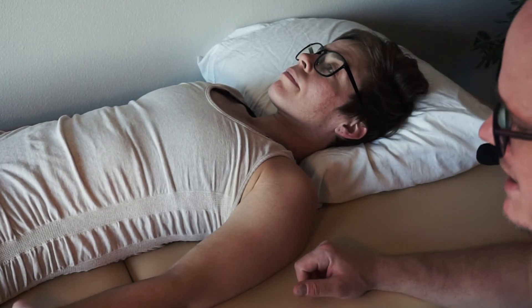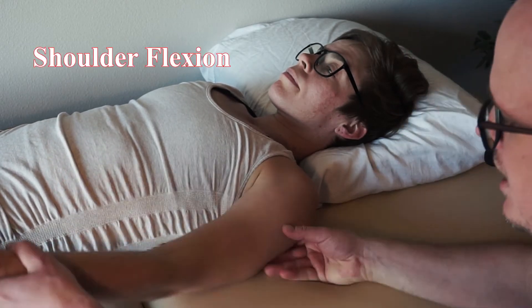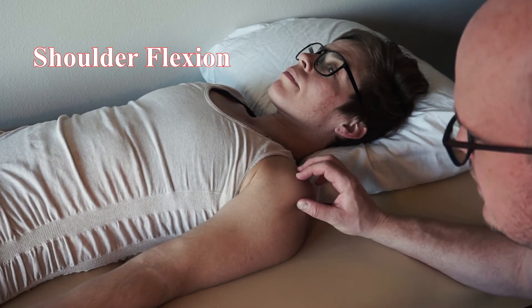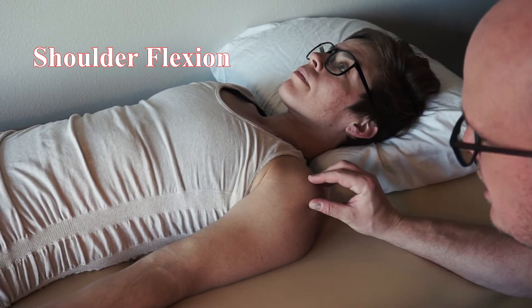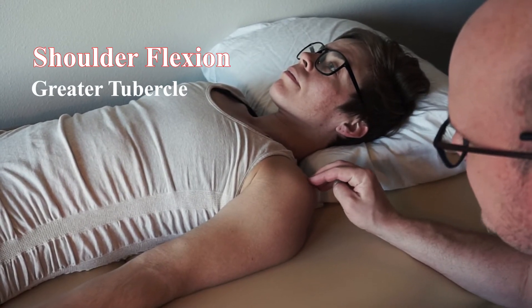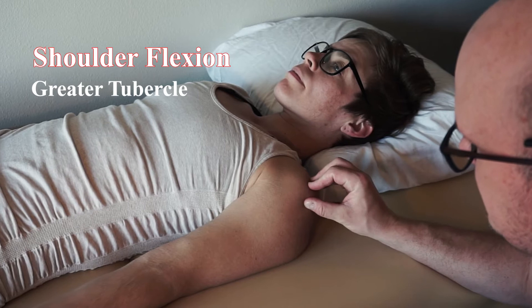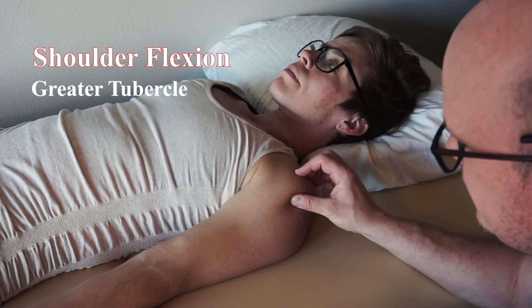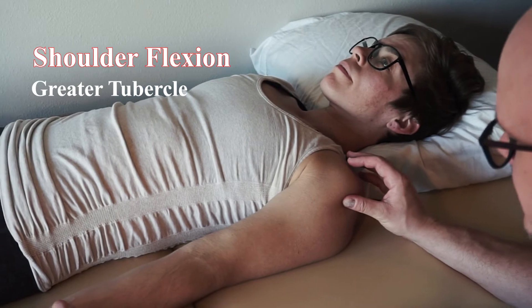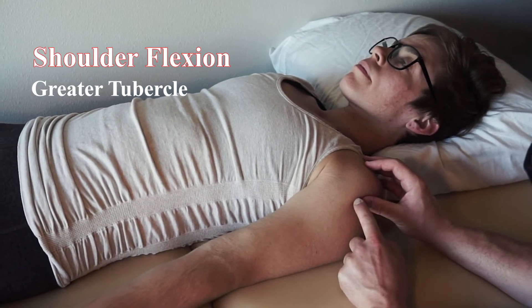First, a few basic palpations we need to look at. The fulcrum for flexion and extension is going to be the greater tubercle. So if you find the acromion process — it's the flat shoulder pad on top — come right down off of there and you're going to feel that bump. That's the greater tubercle. Be careful not to just push on that bony prominence. That's where our fulcrum is going to be.